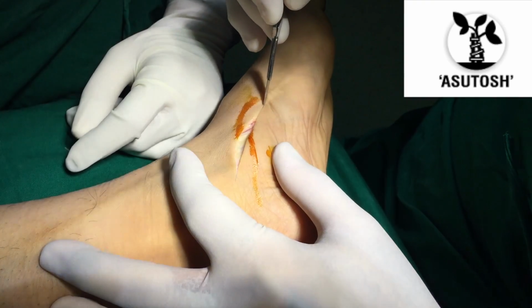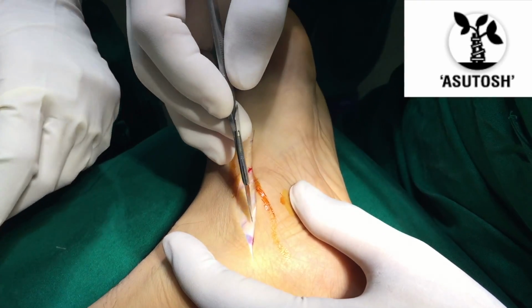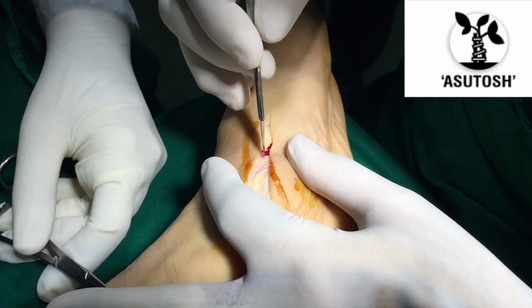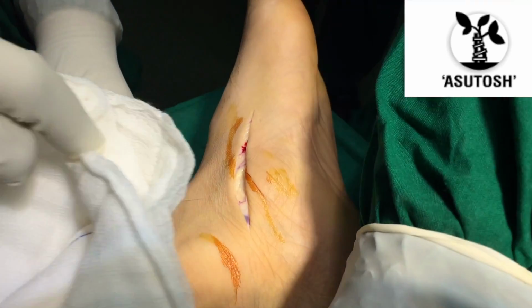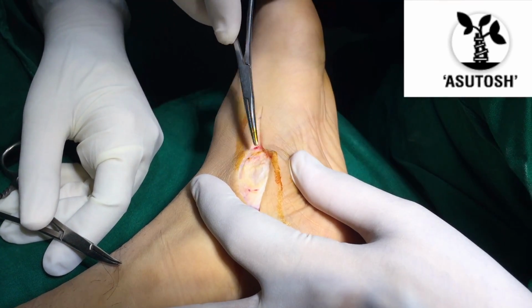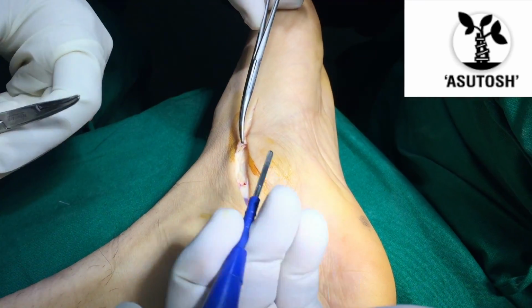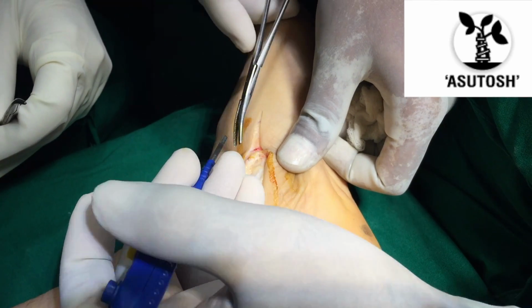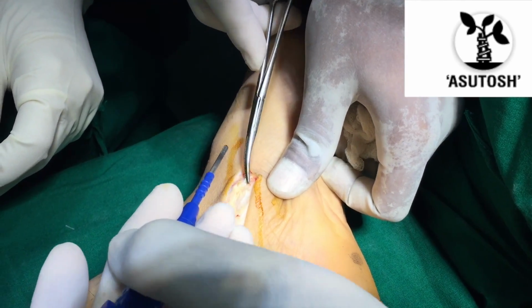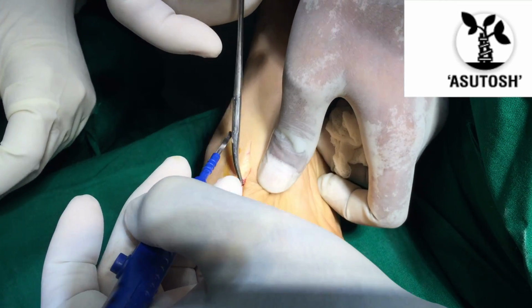We are incising through the skin, and we do not encounter much subcutaneous fat. We enter into the deep fascia, but before that there are some communicating branches of the saphenous system that we need to coagulate with a cautery before proceeding towards the posterior tibial tendon, because they have a tendency to bleed if not well coagulated.